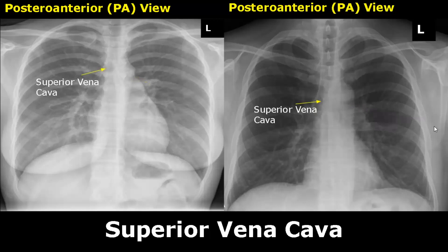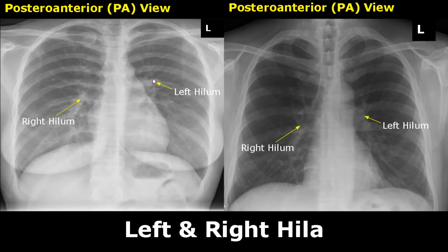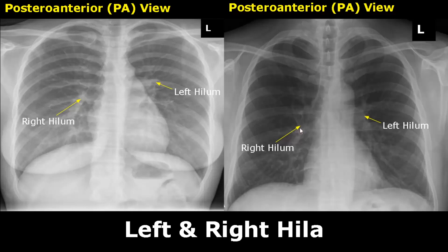The superior vena cava is seen over here, superimposed over the trachea and the bronchus. Here is the left hilum; it contains the left pulmonary artery, the left main bronchus, two pulmonary veins, nerves, lymph vessels, and other blood vessels. The right hilum contains the pulmonary vessels, the right main bronchus, nerves, lymph vessels, and other blood vessels. The left hilum is slightly higher than the right hilum.